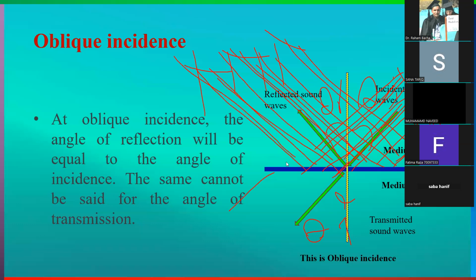You should know about this anisotropy in the case of oblique incidence and specular reflectors, because examples of specular reflectors are tendon fibers, muscle fibers, and other large reflectors, for example the diaphragm, the cortical part of the bone, periosteum, muscle fascia, muscles, tendons, ligament fibers, and so on.